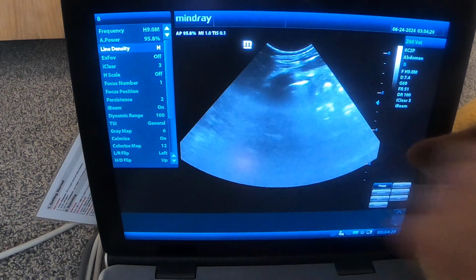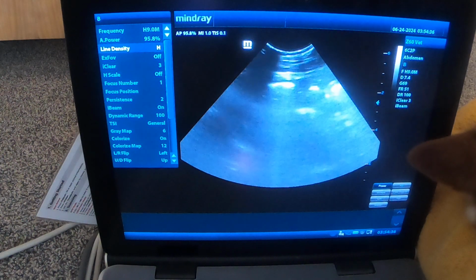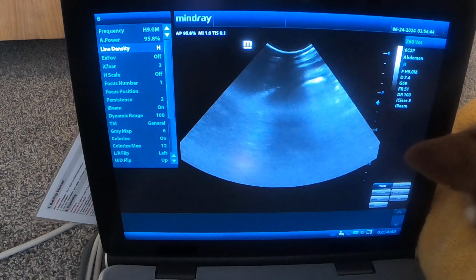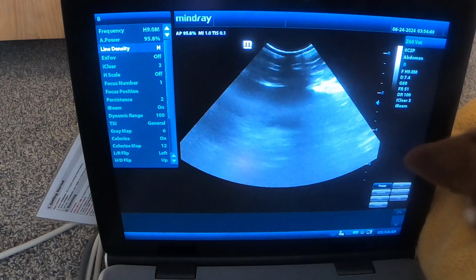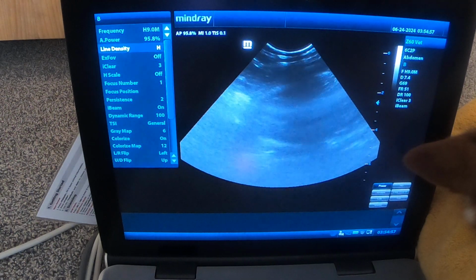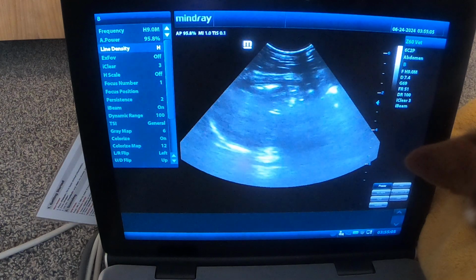If we look, the most cranial small intestine up by the liver is going to be the duodenum. So this is a great area to start looking for pancreas and stuff too, which we can see coming into our view right up there. But that's not what we really care about for our FAST scan, right? We just want to know, hey, I see liver. Cool. There's some liver. I see my right kidney. I'm in the right spot. Do a big old scan all around here and making sure there's no fluid going on. Perfect. So no fluid. I like that. And then we can move on and say that his fluid score is 0 on here.